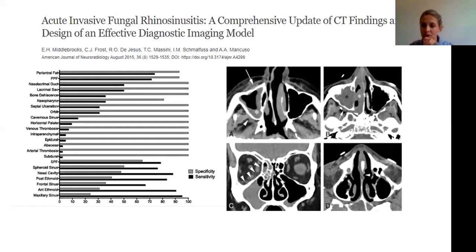And in these images, there's 4 of them. These are patients that have established findings in invasive fungal rhinosinusitis. In image A, there's an axial image which shows unilateral mucosal thickening, and it involves that right maxillary sinus, indicated by the asterisk. And then there's some soft tissue infiltration in the right anterior periantral fat, which you can see in picture A by means of the arrow. And then you also have this posterior periantral fat, which is demonstrated by that small little arrowhead.